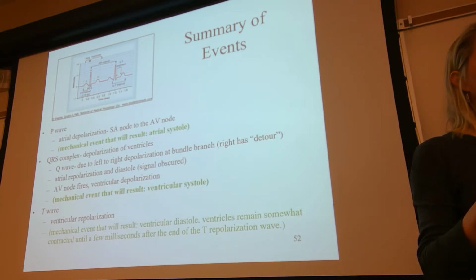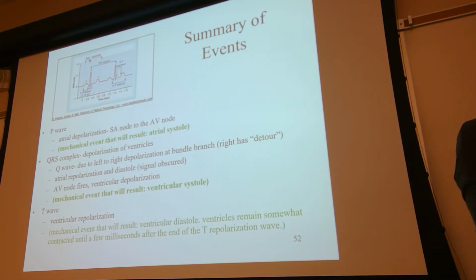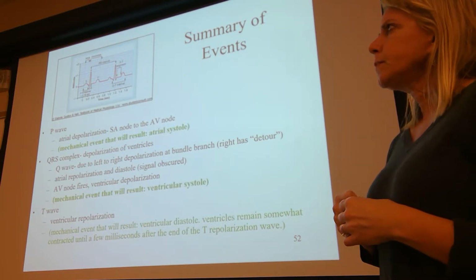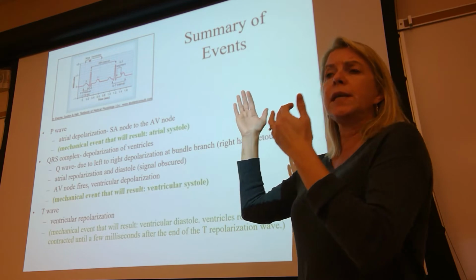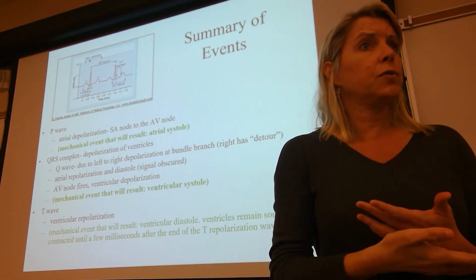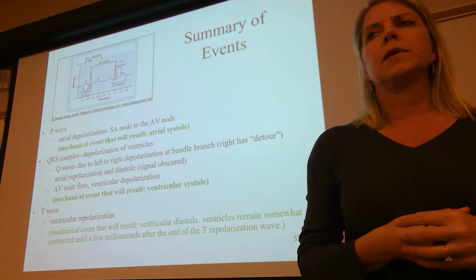Remember, we talked about this last week, Tuesday, right? That picture would definitely change if lead 2 was strapped on backwards. We learned that on Tuesday.